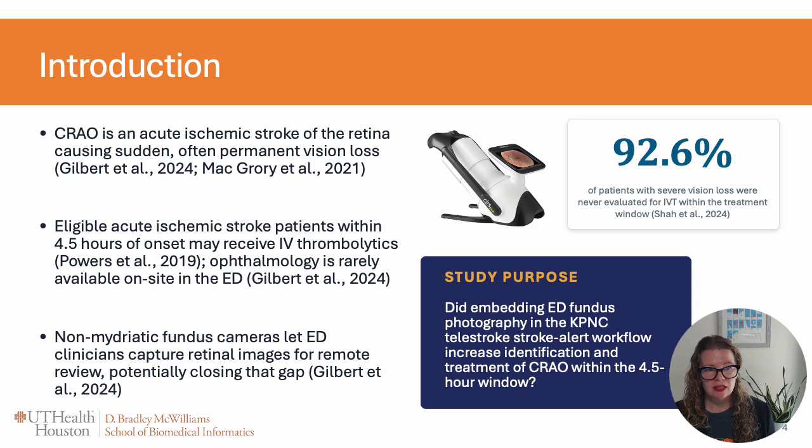Now, the challenge here is that ophthalmology for these CRAO patients is rarely available on site in the emergency department settings. So our study wanted to look at whether or not embedding fundus photography in the ED in the Kaiser Permanente Northern California telestroke network would improve or increase identification and potentially treatment of CRAO within the treatment window.